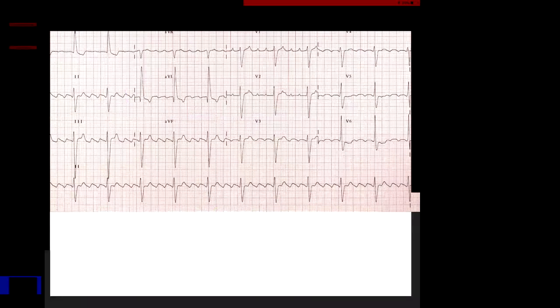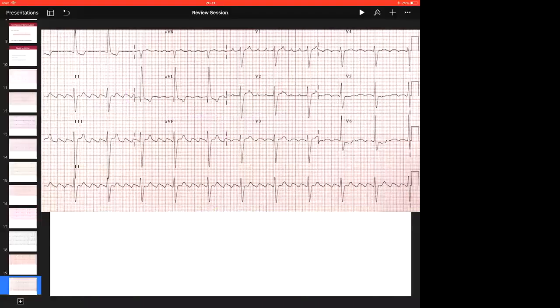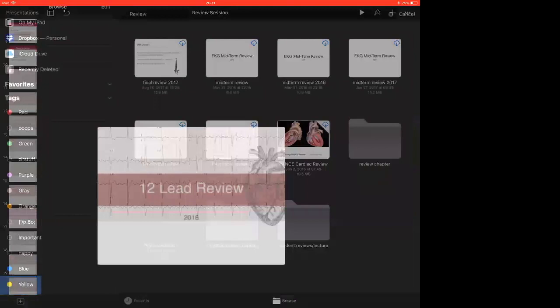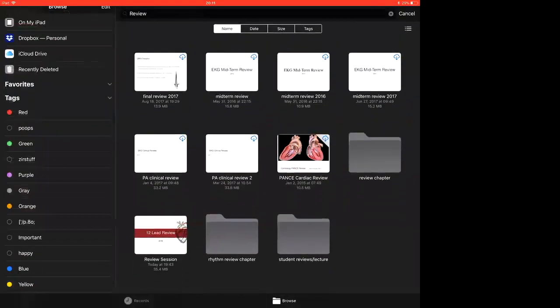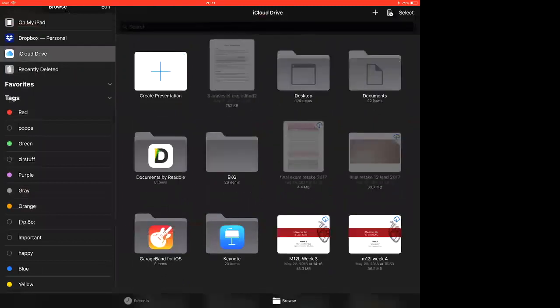I have a quick question. So you listed one of the conditions or characteristics of the AFib rhythm, that it has to be tachycardia. And in the homework, there's some AFib and they are bradycardia, like 45 or 55. Yeah, it shouldn't. No, it does not have to be tachycardic.